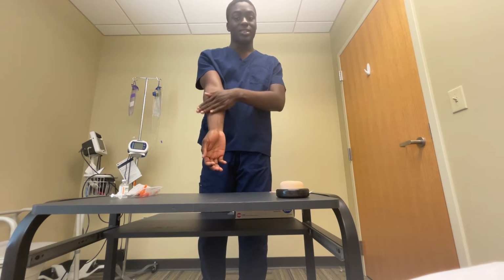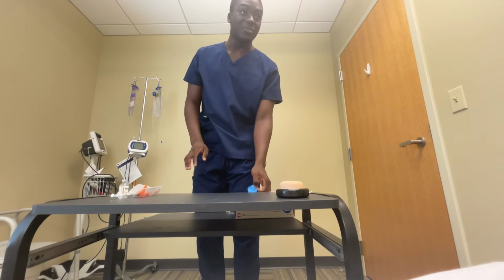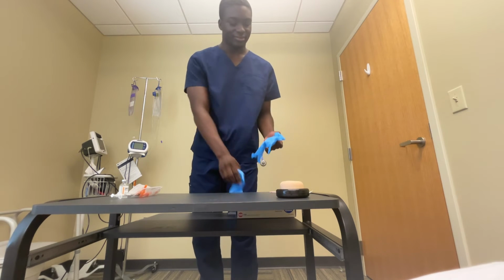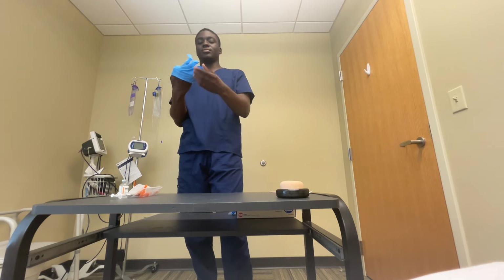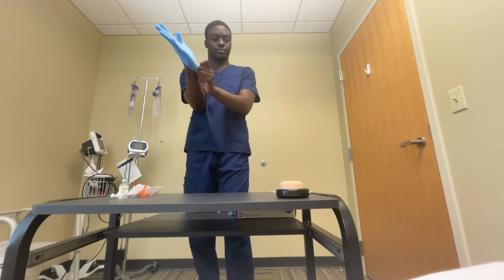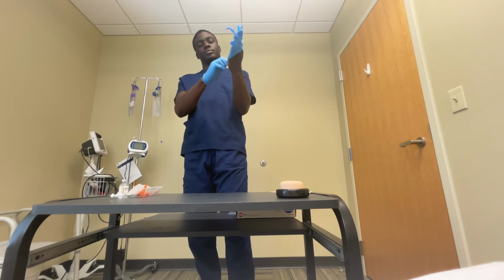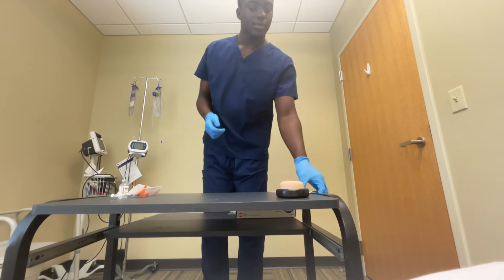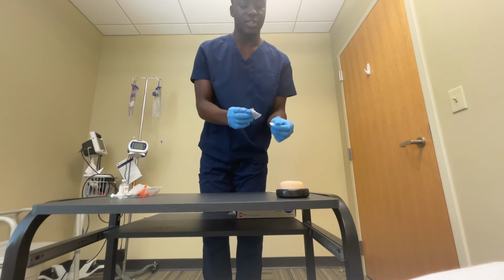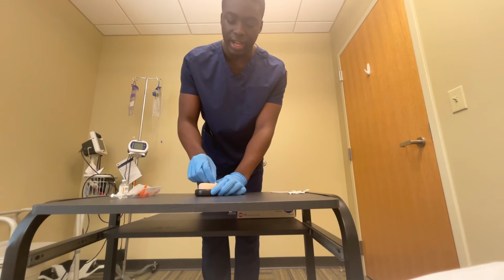And then could I see your right forearm? I'll try to locate a ventral surface on the arm, appropriate area for the intradermal injection. And then I just need a moment to prep my material. Then once I locate my site, ventral surface of the right forearm, I'm going to start from the site in a circular motion outward.